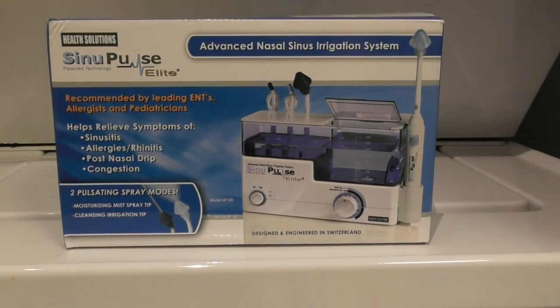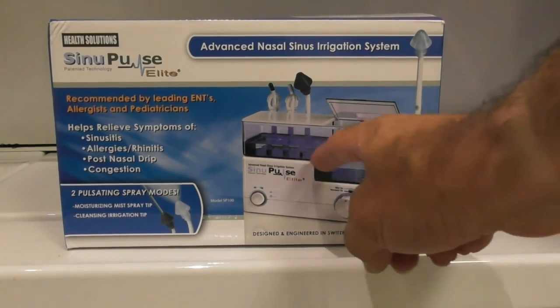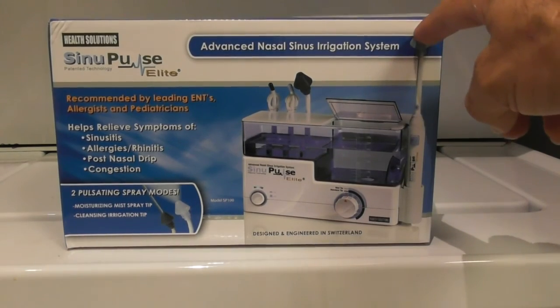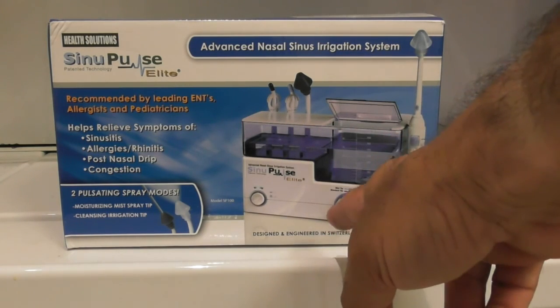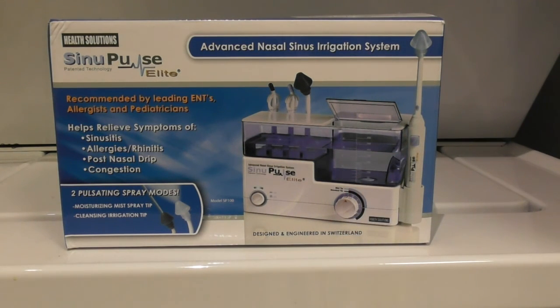This is a review of the SinuPulse Elite nasal irrigation system. These are mostly used for allergies — you take a saltwater solution, mix it with water, and through a neti pot or a pressurized unit like this it pulsates the water and shoots it into your nostrils. The idea is that it goes in one side of the nose and out the other, flushing through the nasal cavity to remove allergens and clean the hairs inside the nostrils.